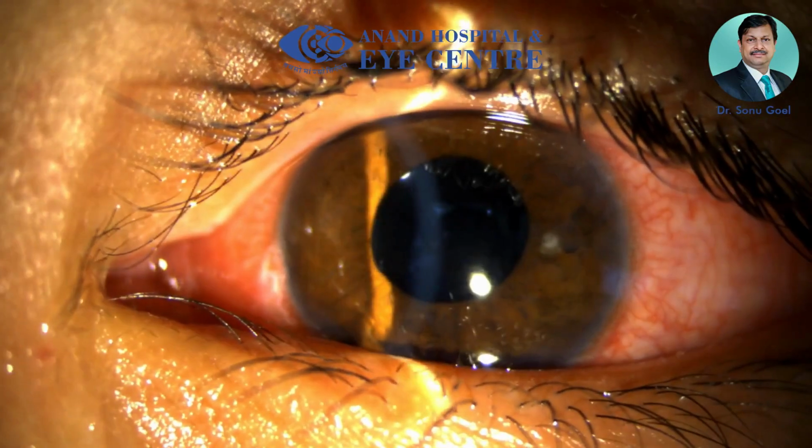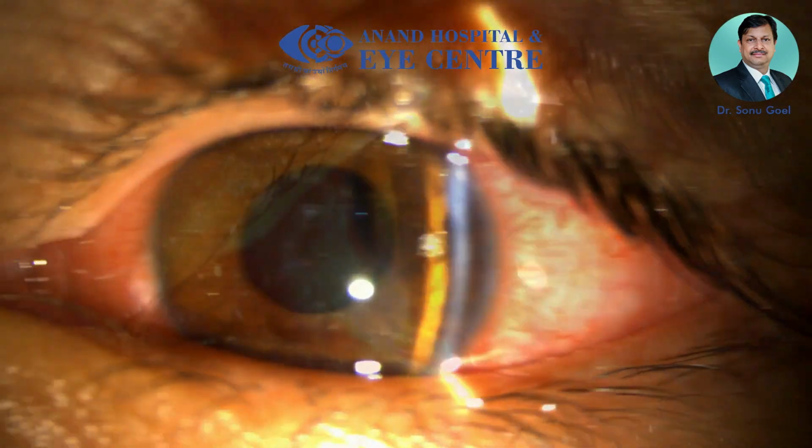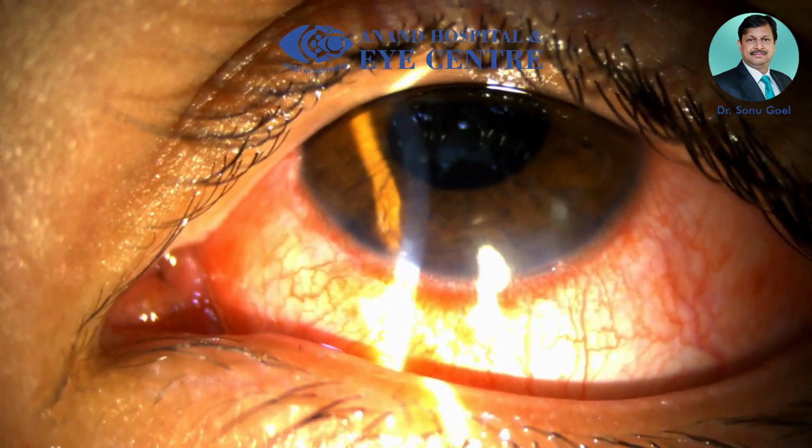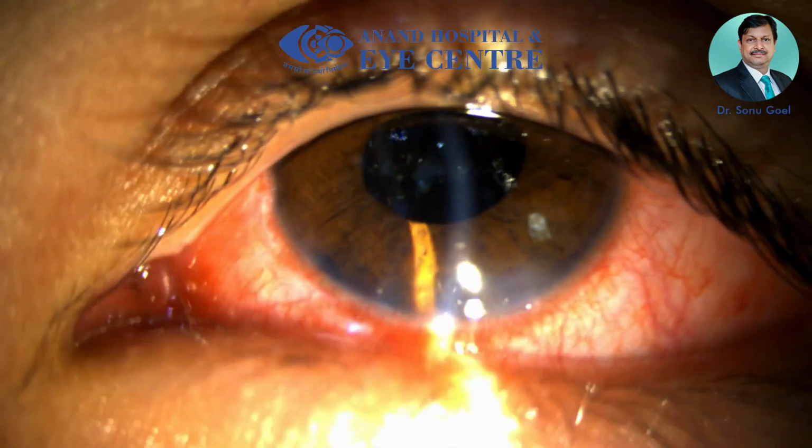As you see here, the pupil is very regular. There is a small amount of dialysis which can be seen and evident, but the lens is stable and good vision can be achieved.